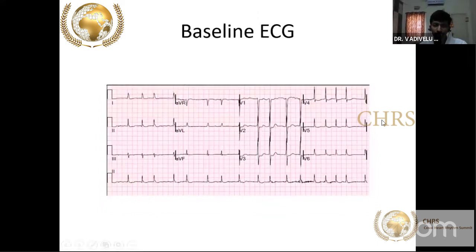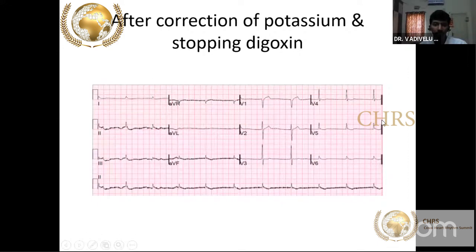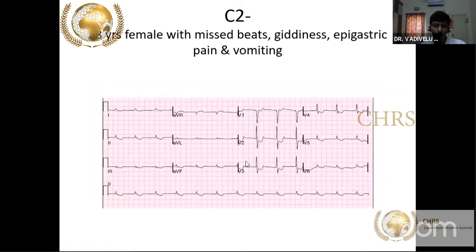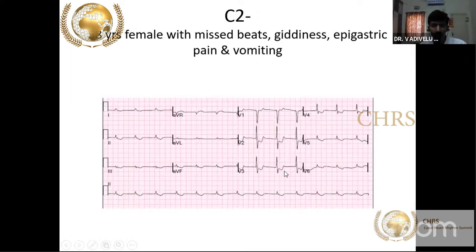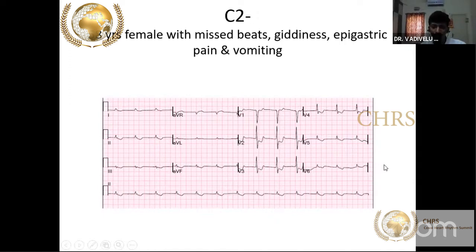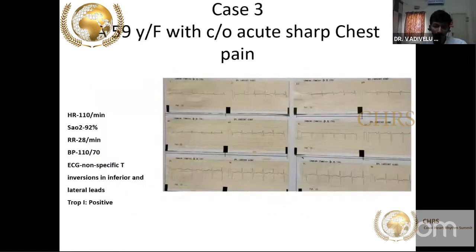After correcting potassium and stopping digoxin, the ECG normalized. Sometimes patients present with chest pain and breathlessness with this ECG. This patient should not be treated as an MI or non-ST elevation MI — clarify the drug history, especially digoxin, and seek electrolyte imbalances.